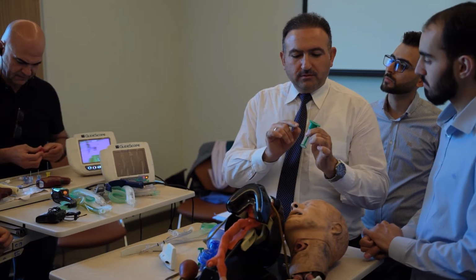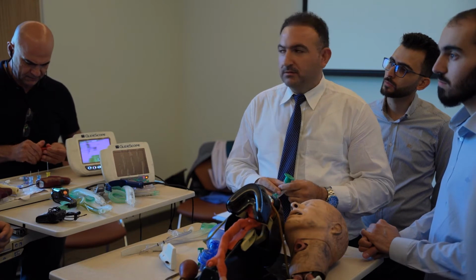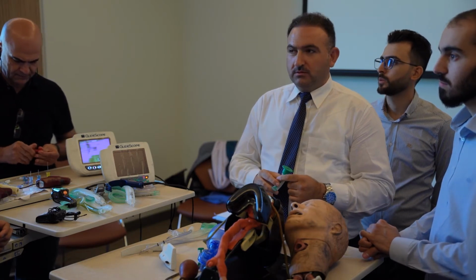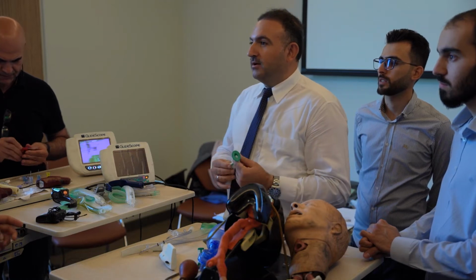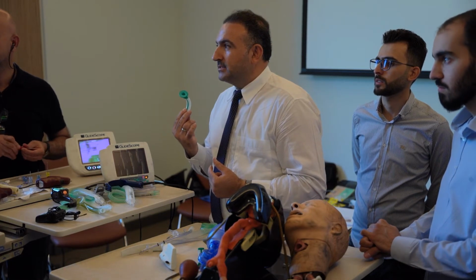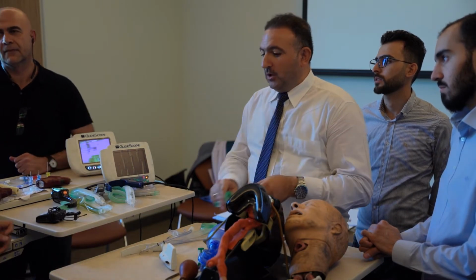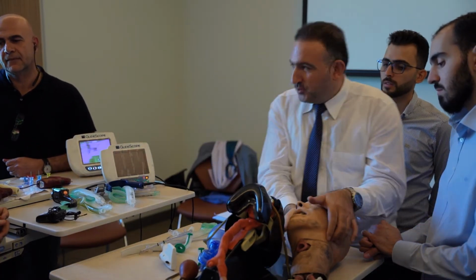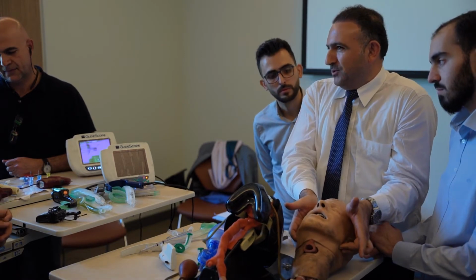If we have the larger one, can we put it? Yes, larger one? I think no. Why? Because it's problematic to the airway. It brings gagging. What we need is to save the position of the tongue, to not go back, and just protect the tongue, which is simply achieved by jaw thrust.